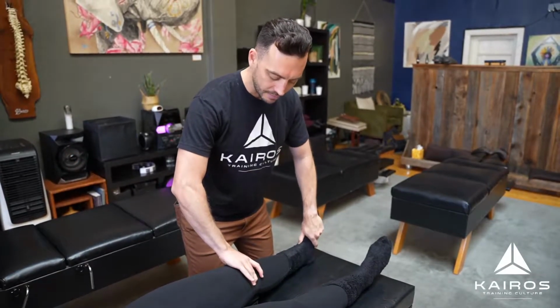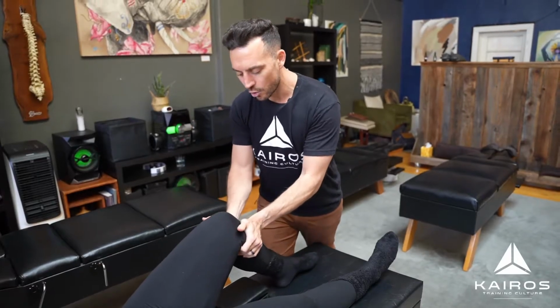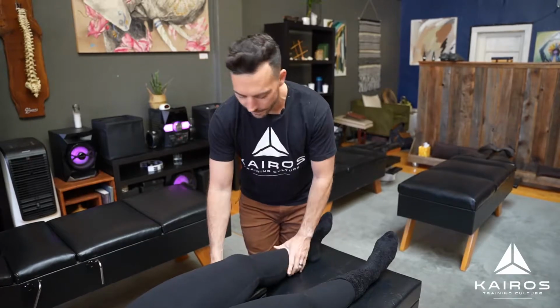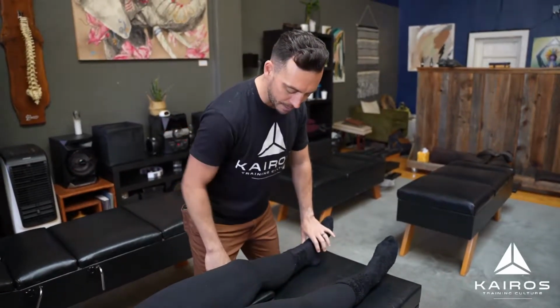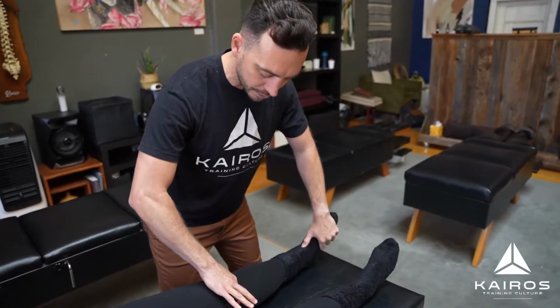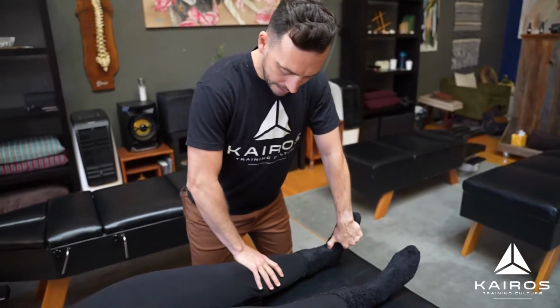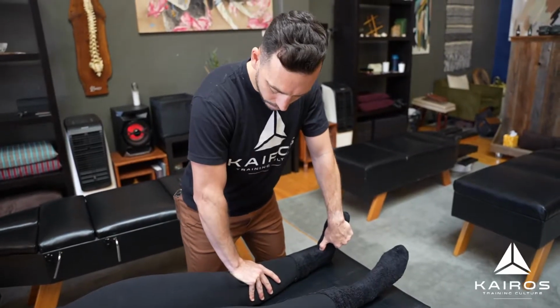So if I notice that the knee is rotating out, they have limited movement, and they don't have the ability to rotate inward properly, I love to use the ChiroLux Spark for getting the proper movement back in there. So I can prop it up and then put internal rotation, or whichever direction I need to go into. I'll dorsiflex the foot to get that movement pattern in, and then also right along that joint line, now starting to adjust through. So like that.